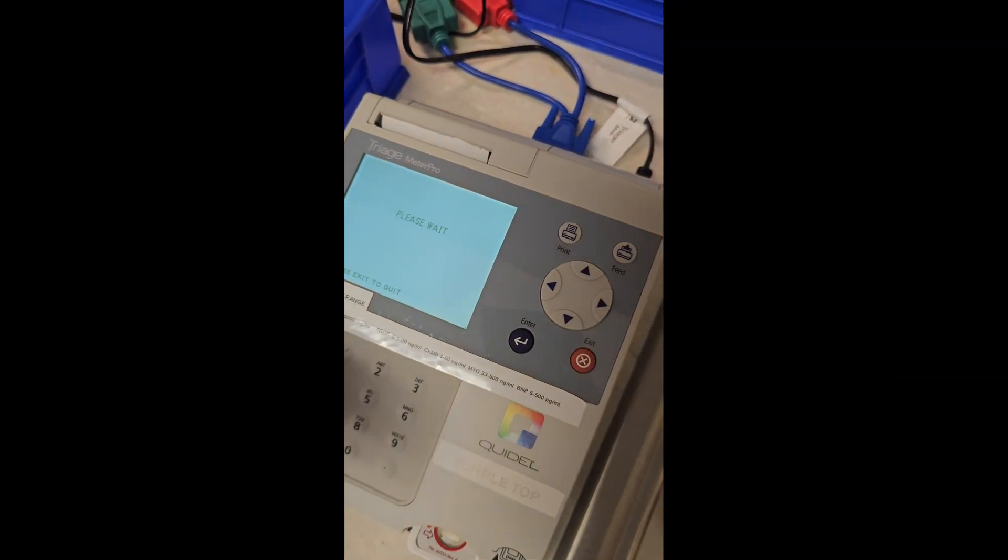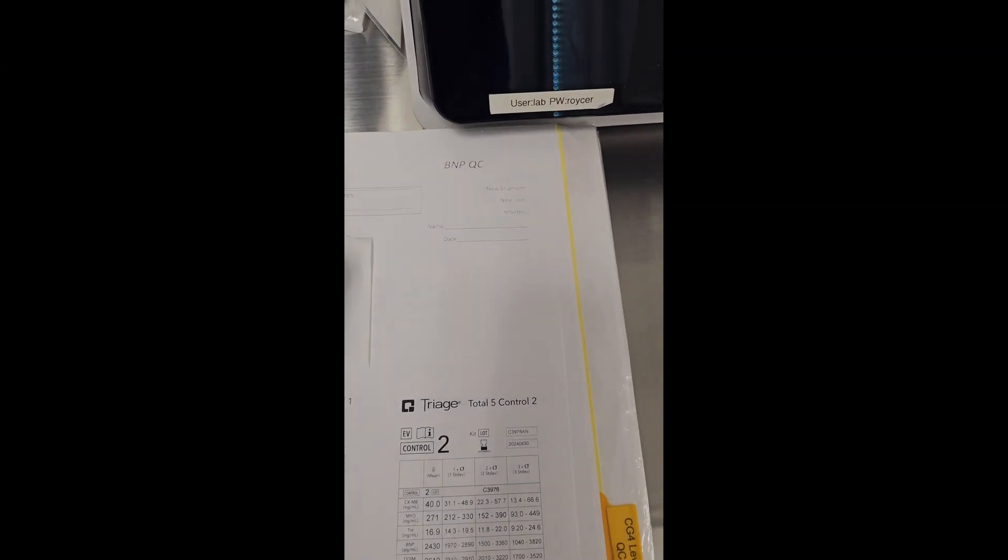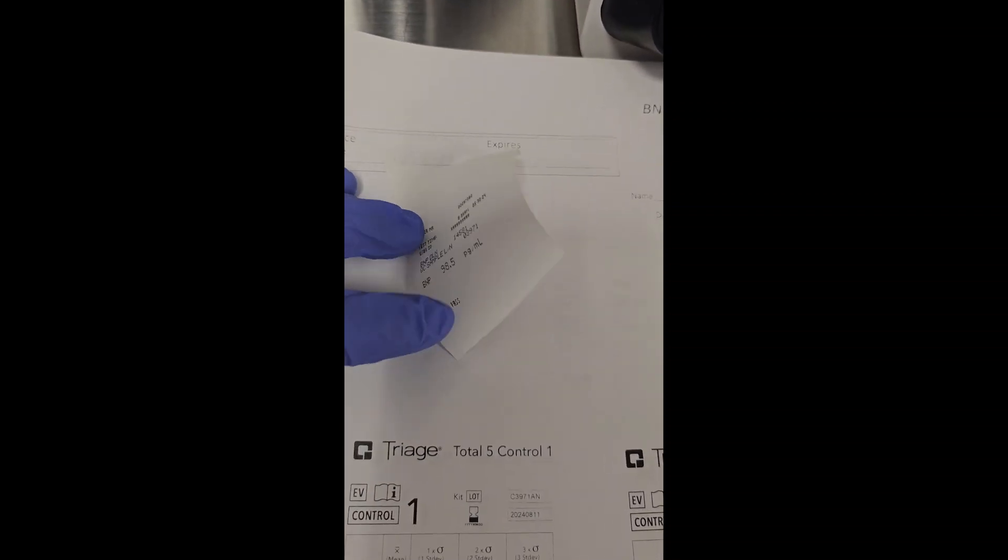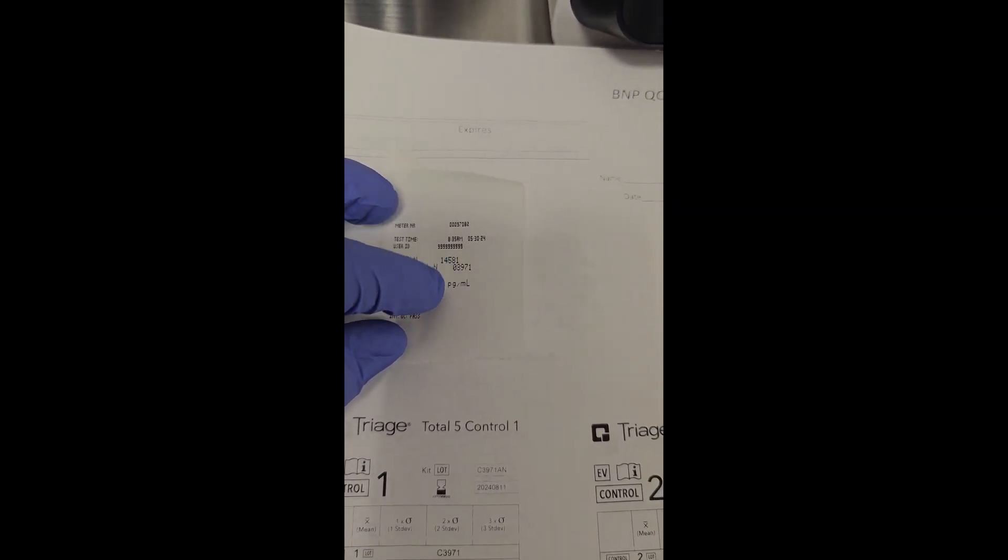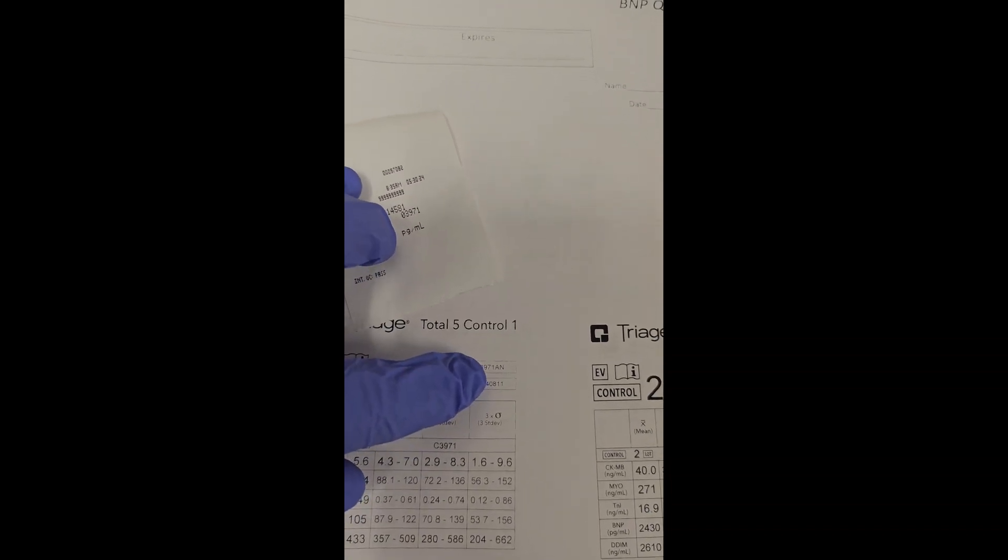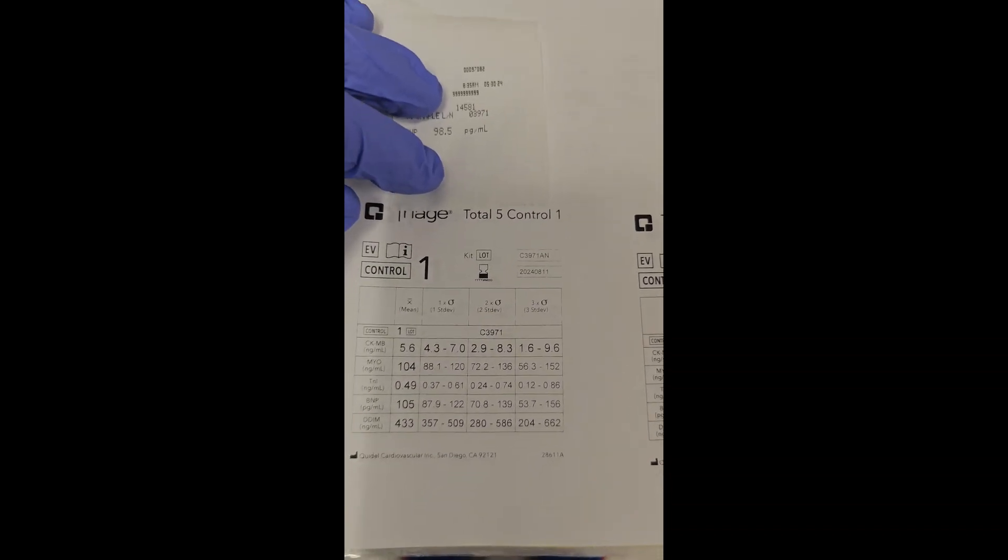That's going to run. Let's take this over here and tape that down. We want to make sure that this lot number, the QC lot number 3971, matches this number 3971, and then we're going to take a look at our results.